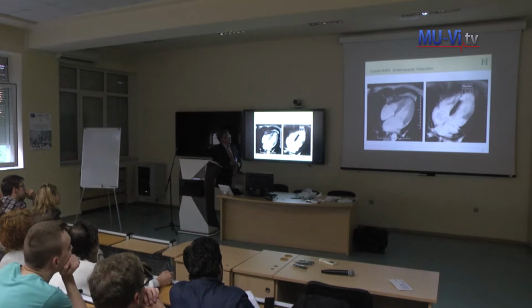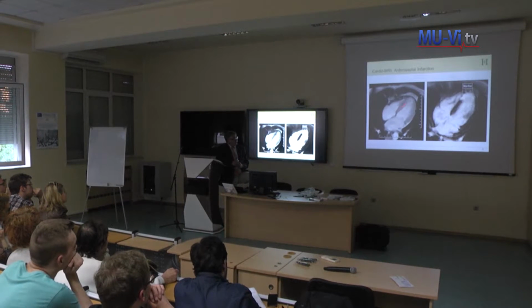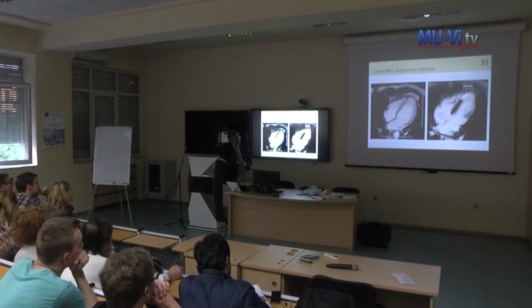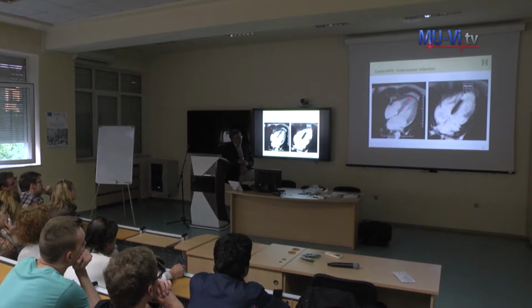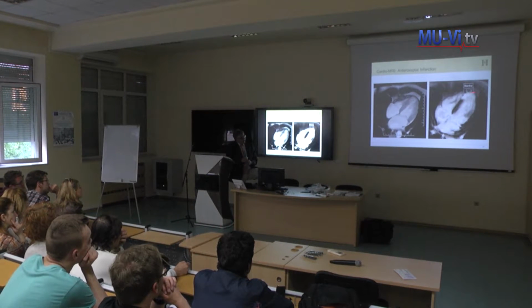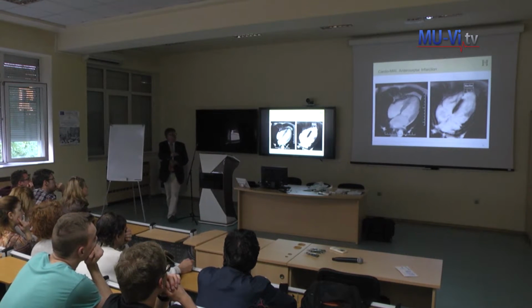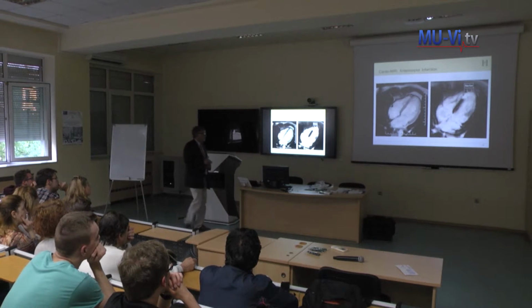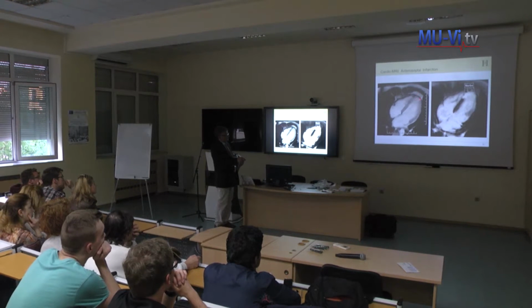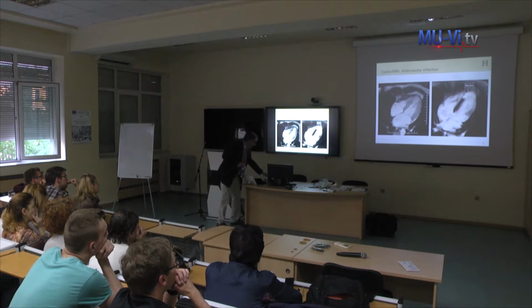And this is an anteroseptal infarction. It's a small one. We did echo, we did MRI, and we found a small infarction because of the disturbed wall movement of the apical wall here. But in late enhancement, we see the scar is much larger than we thought in the Fiesta, in the moving film. You just see a bit of disturbed wall movement apically, and here it's much larger.